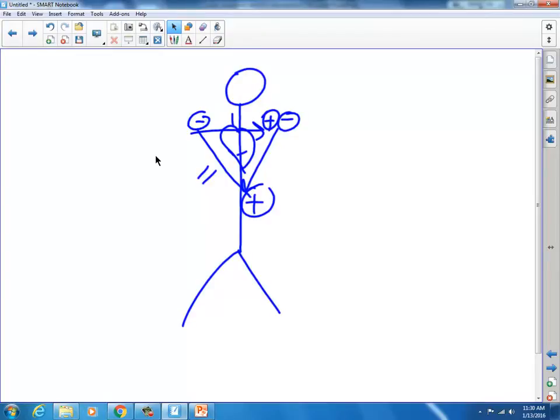Let's say for whatever reason I wanted to look at lead 1. Where is my positive? Left arm, negative's right arm. All right? Let's say I wanted to get a lead 3. My left arm turns to what? Negative, and my left leg turns to positive. All right? I don't have to do anything but just tell the monitor which lead I want to look in. All right? It knows how to change the poles.